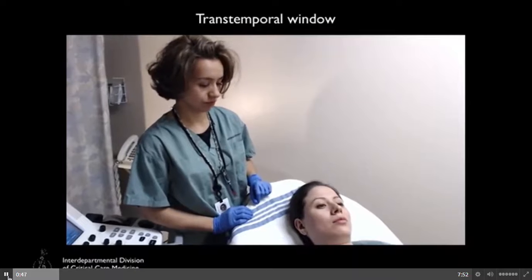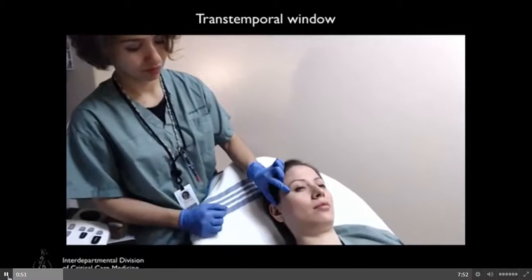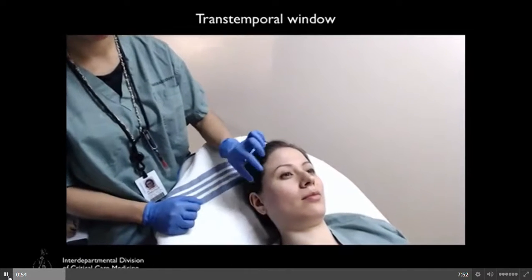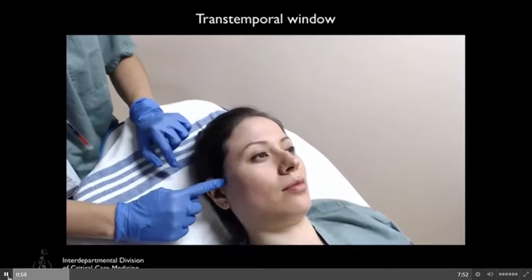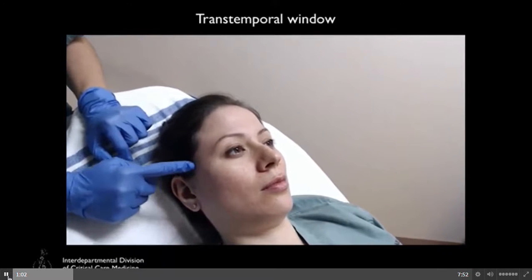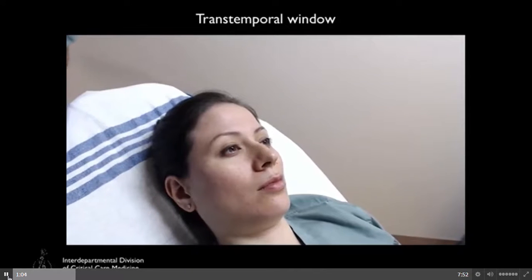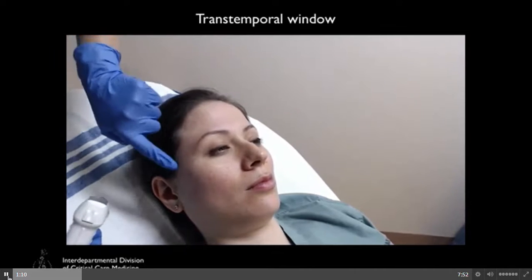The patient is lying supine, and the sonographer is standing by the patient's side or by the head end of the bed. The transtemporal window is the thinnest part of the temporal bone and is located anterior to the ear and above the zygomatic arch. Using the gel, the sonographer places the probe at 90 degrees with the probe marker facing anteriorly.